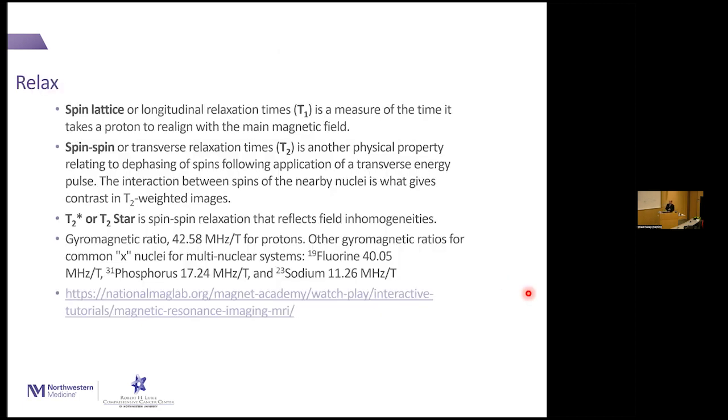So how does MRI work? What we typically image are protons. There's other things that you can image, which I've got listed down at the bottom there, fluorine, for example, or sodium. But most people image protons, and the proton interaction with, say, tissue, bone, air, fat, all those things contribute to signal or contribute to what we see in the image.